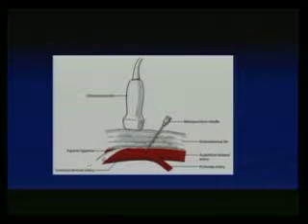This is the inguinal ligament, usually from the anterior superior iliac spine to the pubic tubercle. That's your inguinal ligament. And you divide 1/3 of the distance. That's your common femoral artery. So once you visualize with the ultrasound, you come at a 30-45 degree angle with your needle. I usually use a micropuncture needle to get the access under ultrasound guidance.